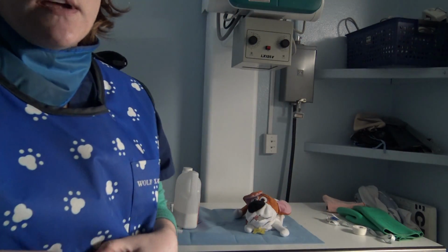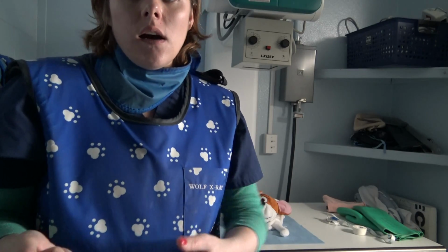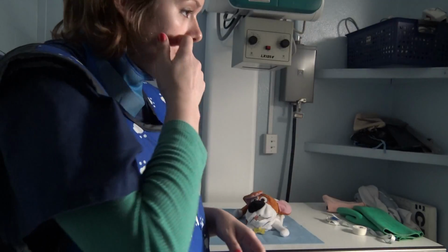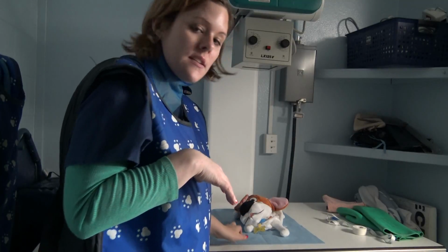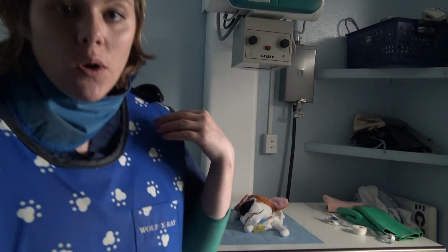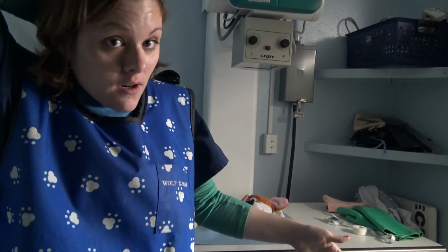Typically, if this was a real case, we have someone restraining in sternal recumbency, their left hand over the right hand controlling the head. And we typically do it on another table, not the x-ray table. In this case, I'm going to go ahead and put a protective drape down. You just want to make sure you're not getting any of the barium on the x-ray table to show up on the x-ray and cause artifact.